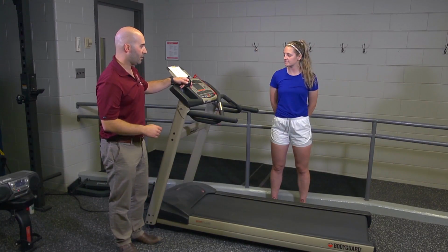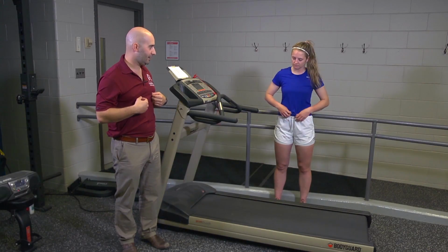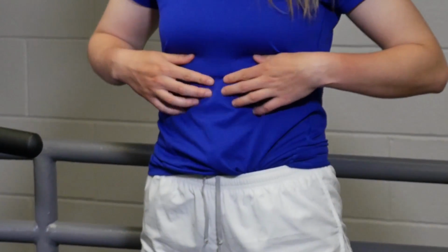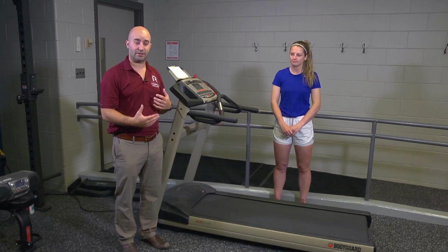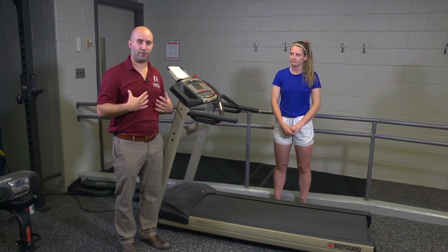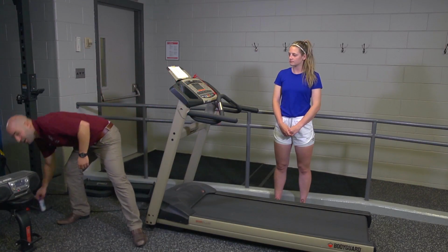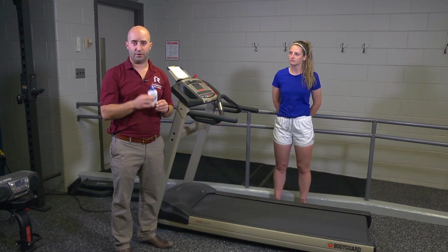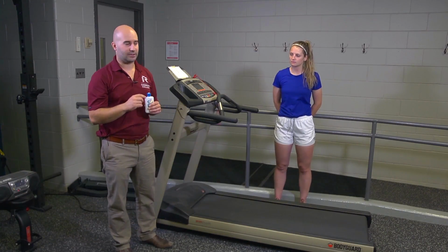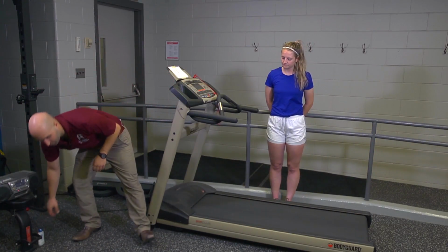So Clara's already got her heart rate monitor on. Typically, you want to make sure it's fairly tight. We've got it right under the xiphoid process, underneath the shirt, so she knows that it's comfortable enough. Oftentimes your clients might sweat, so as they're moving around, it might get loose, so you want to make sure it's quite snug. If you have a hard time picking up the frequency, you can also use conductive jelly or a couple of drops of water. You don't need a lot of it, and that can help the transmission of the information from the heart rate monitor to the receiver as well.